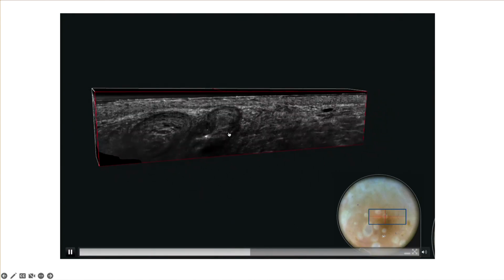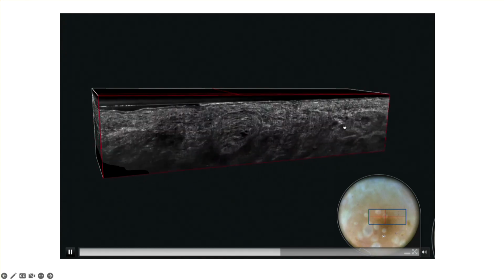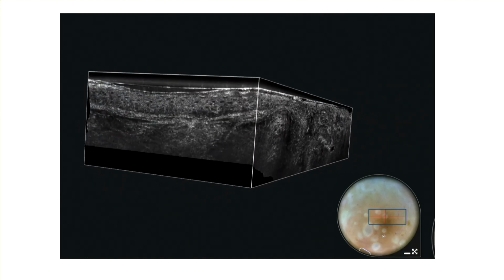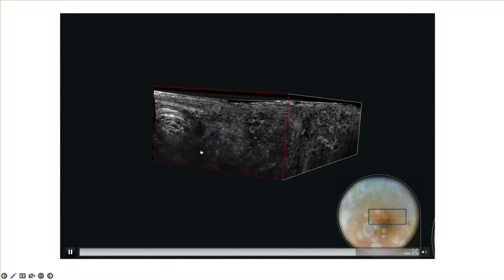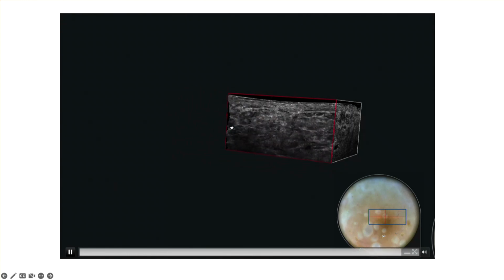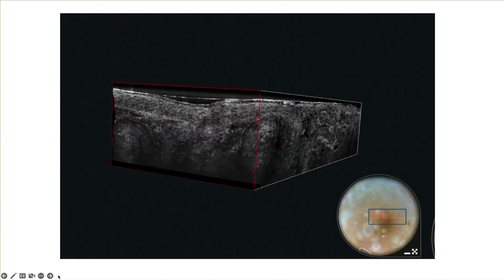But when we see it in vertical, even here are the calcifications, and here we are seeing the stromal reaction, and this very micronodular basal cell carcinoma. It was a very small basal cell carcinoma of the forehead, and here with another view, the calcifications that are associated with this microinfiltrating basal cell carcinoma. Here, all the stromal reaction around.